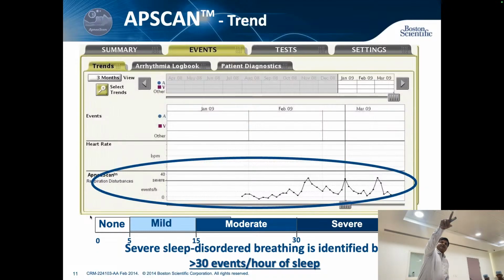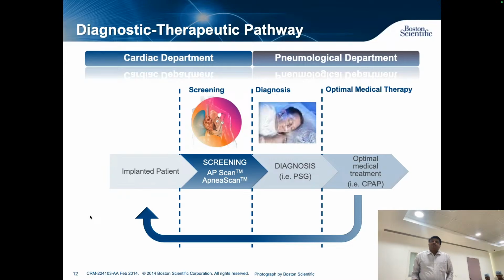You can go back and check by clicking the month 3, up to 1 year, so we can see it in the events. If you go to the trends, we can get the data of this. So these are the diagnostic features, and there is a possibility.